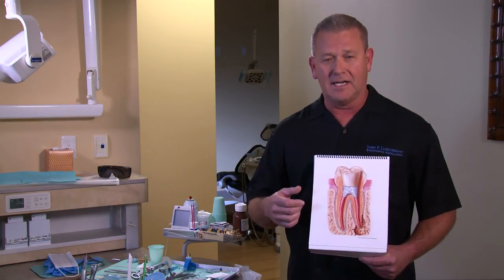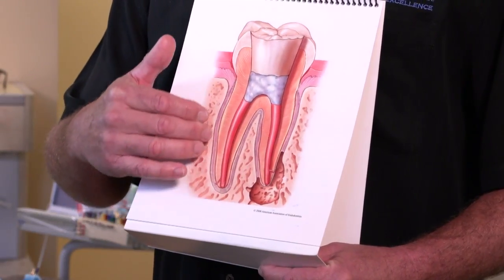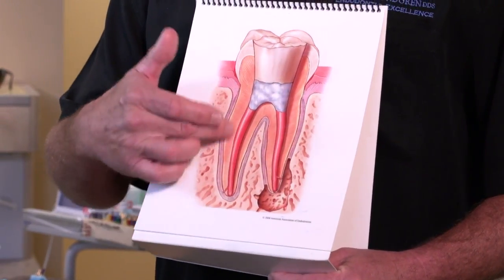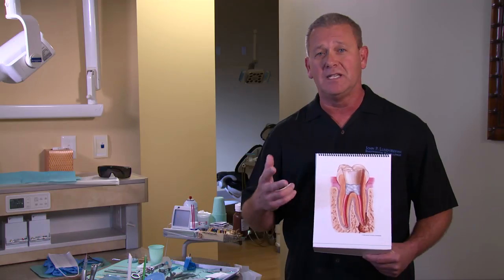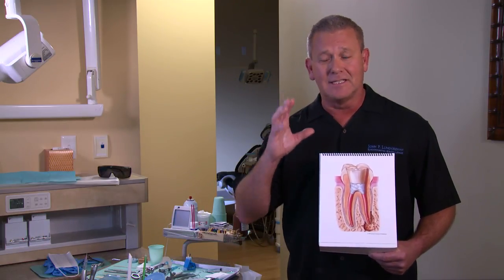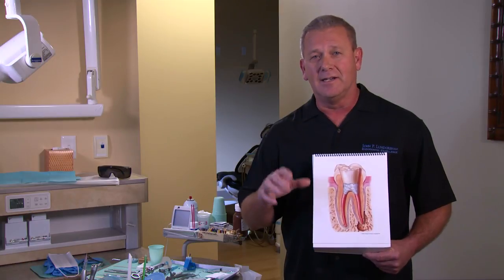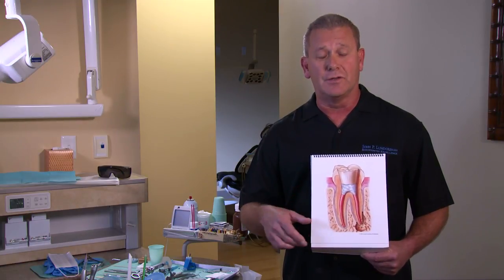Teeth that have had infection, we may opt to put medicine in for a week or two before we get to this stage and fill it. So it may be a 2-appointment procedure. I'm the tooth whisperer. I listen to the tooth, it tells me what to do. If it's really infected, we're going to put some medicine in there and give you and your tooth the best prognosis.